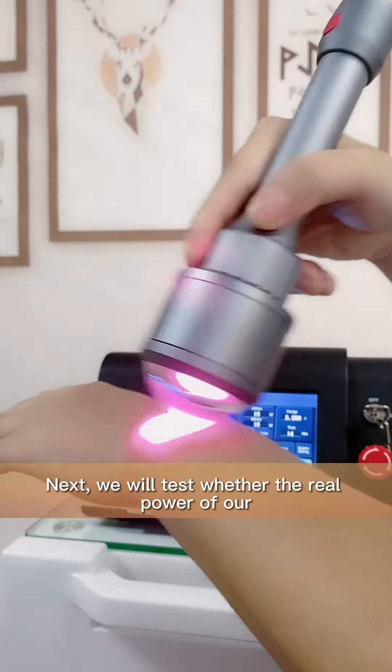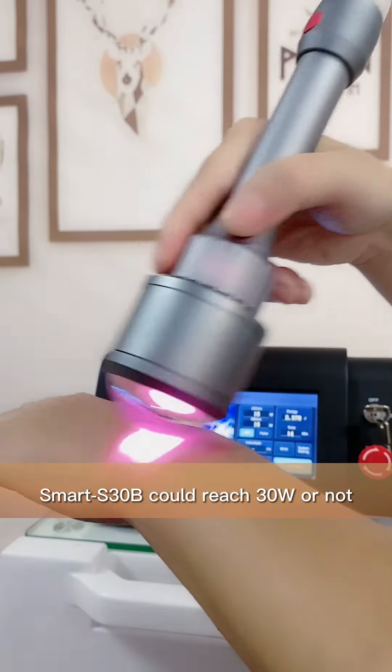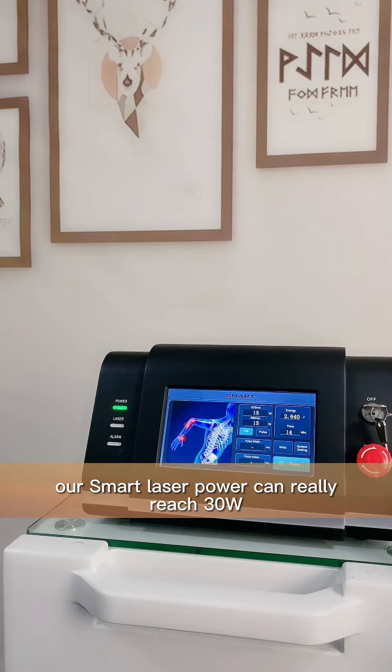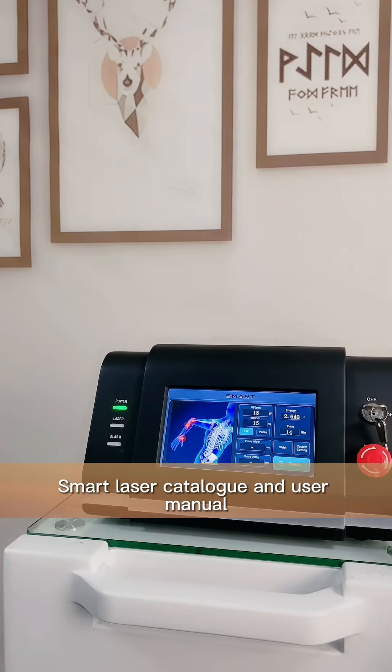Next, we will test whether the real power of our smart S30B could reach 30 watts or not. As you could see from our smart power testing result just now, our smart laser power can really reach 30 watts, which is the same as we write in our smart laser catalog and user manual.